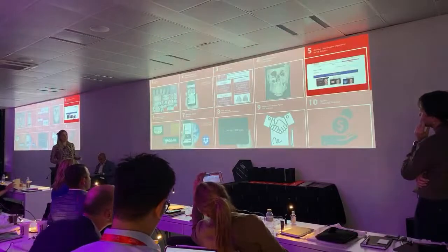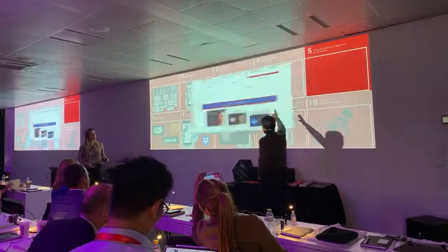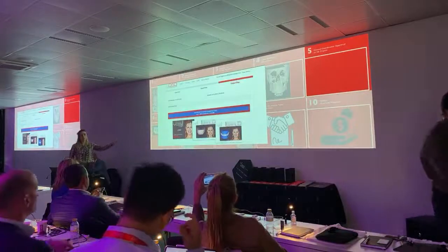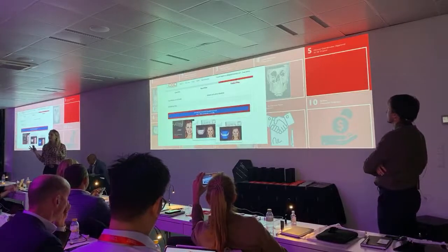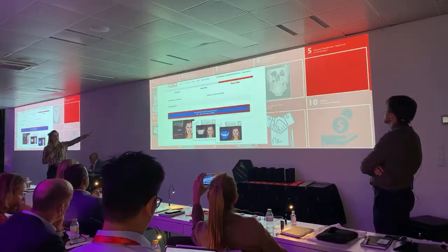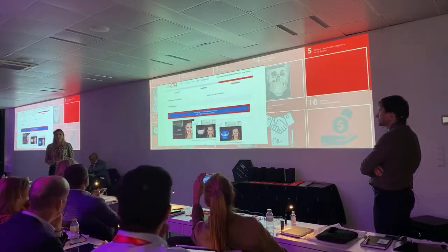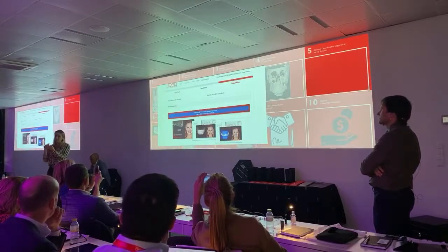And then we go to the 5th step, that is clinical. So this step, if you have a CBCT in-house, the steps disappear because it's part of the first appointment. Everything already goes to the planning center. And then everything will come back on the web, the final proposal of the planning, the treatment plan that the DSD is going to give us, and then your DSD coordinator has to download the presentation and send it to you so you can approve. It's not you that's going to do this. You're going to receive it on your cell phone, and while you're in the Uber going back home, you just see, approve, okay.